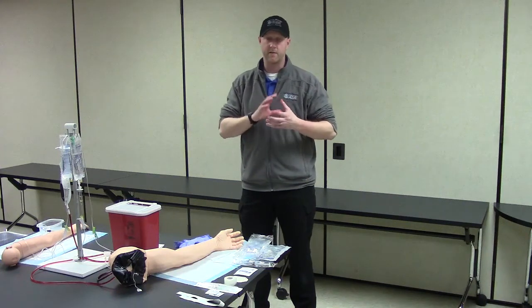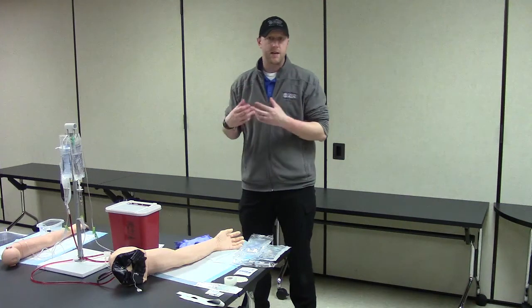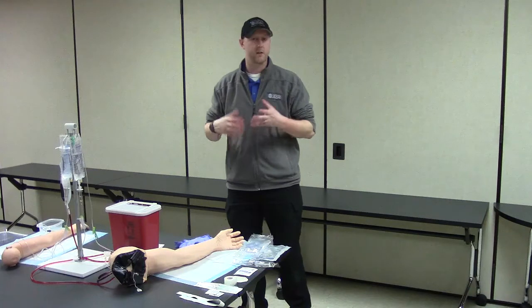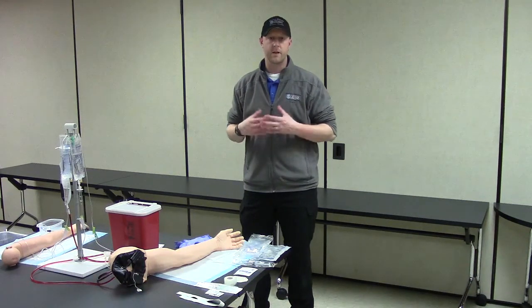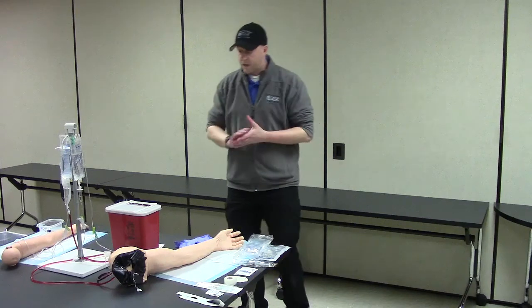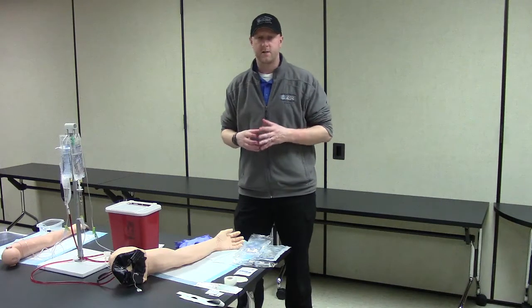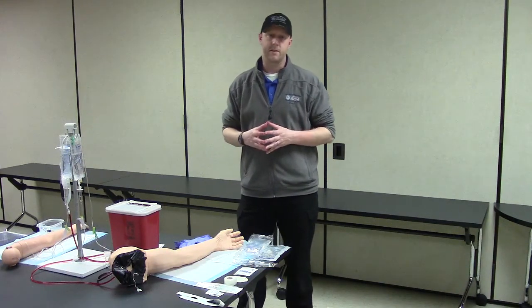That's going to help us figure out: do I need a large catheter, do I need a small catheter, do I need a 15-drop set or a 60-drop set? In this particular scenario, we're going to look at a patient who needs some fluids, so we're going to do what we call a fluid bolus. The skills we're going to perform, you'll be able to follow along using your National Registry Advanced Psychomotor IV Therapy sheets.